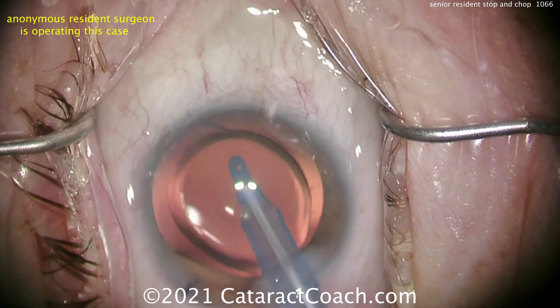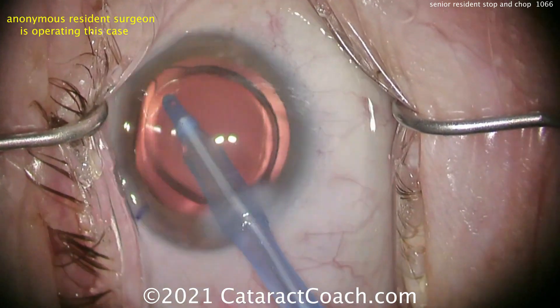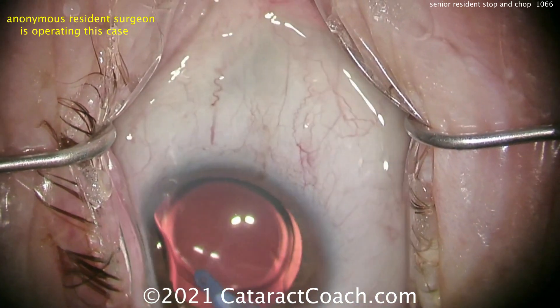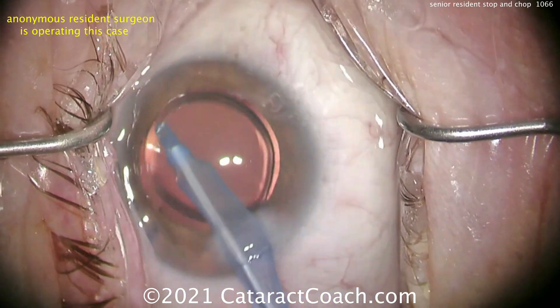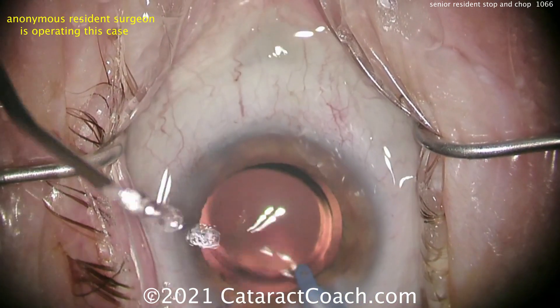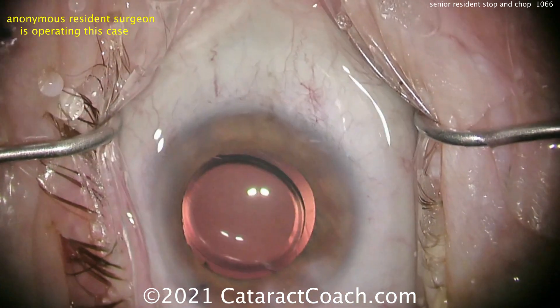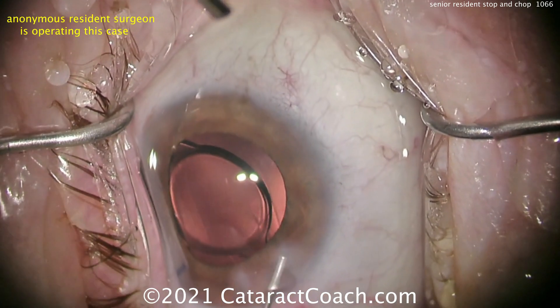Now centering up the lens — looks pretty good. This resident is very talented. Whoever you are, let me tell you right now: there is no question you will become an incredibly talented, highly successful ophthalmologist. You have great surgical skill, but remember, you're at case 160. Show me a video from case 1000 and tell me how much you've improved since then.